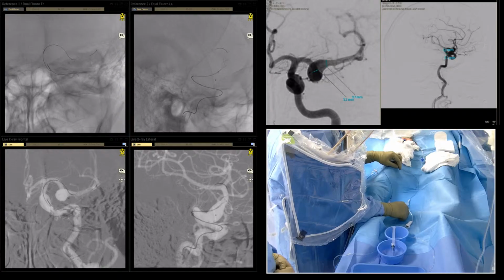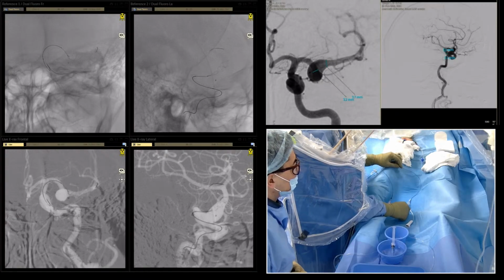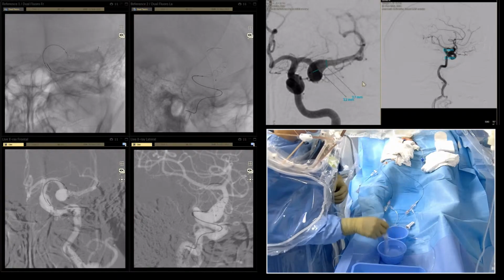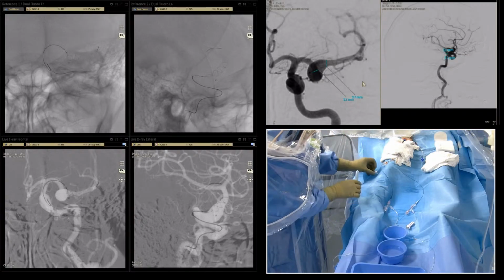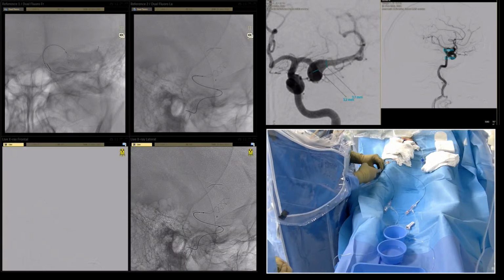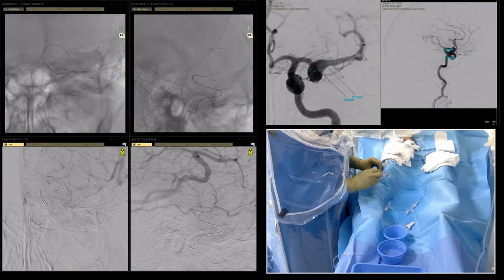Yes, it would be maximum opening. No? It would be maximum opening because of the artery. Okay. Let's do the other. Timer. We can place the timer.